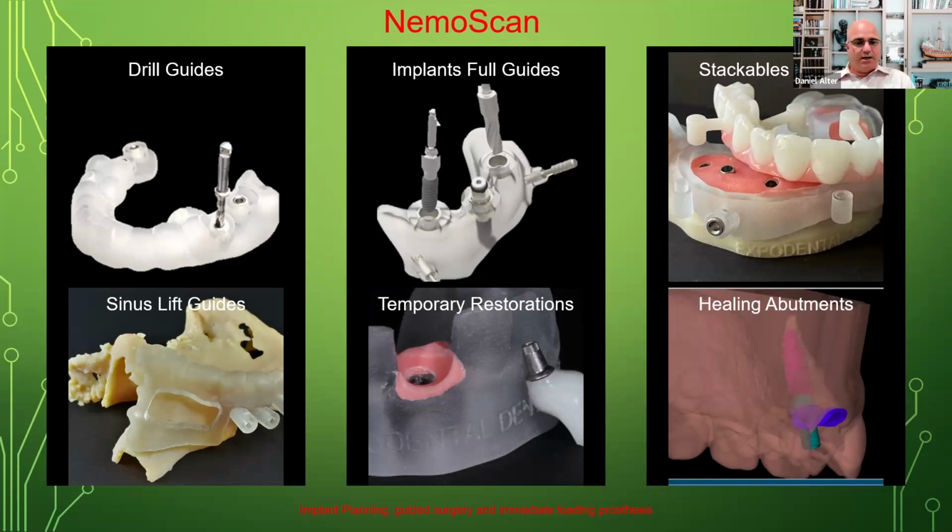The second opportunity for dental laboratories is to align with an oral surgeon in order to do these type of implant supported restorations, starting from surgical guides. Now, obviously, oral surgeons, certainly they do single implants, but they typically tend to do larger, more complex cases, and that's where the stackable guides really come in handy. Now, again, being that this system is a very prosthetically driven guided surgery, you can literally have them go from step zero all the way to a provisional.